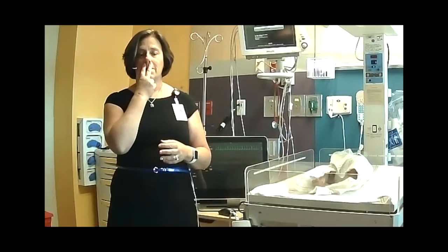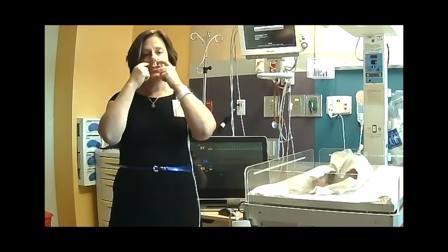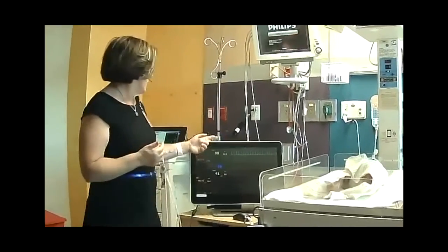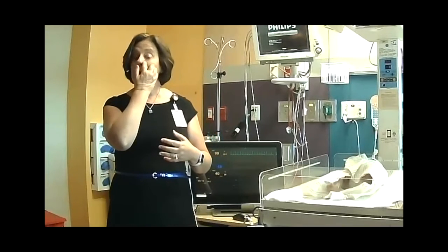So things we'll do to try to make that better. You might see your child on something called high flow. When they're on high flow, it's a little nasal cannula that we put in the nose. It's giving air and oxygen. So it's a step above just a little nasal cannula that just gives a little oxygen. We'll use liters of flow. So to make it easier to breathe, what high flow is to me is kind of like your dog in the car. So your dog in the car, what does he like to do? He likes to put his head out the window, right? That's what high flow is. Big breath, take a big breath, lots of air, slow down. That's what we want to do, slow down. So we'll turn the high flow up and down. The oxygen part is related to the pulse oximetry. The airflow part is to how hard is the baby breathing.